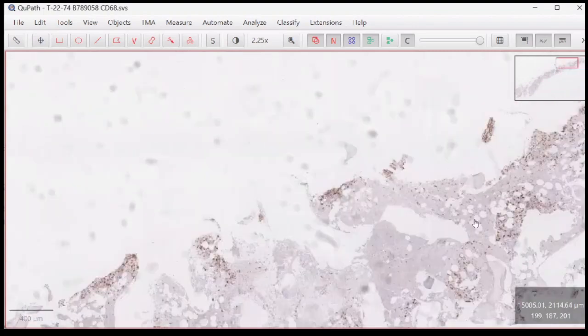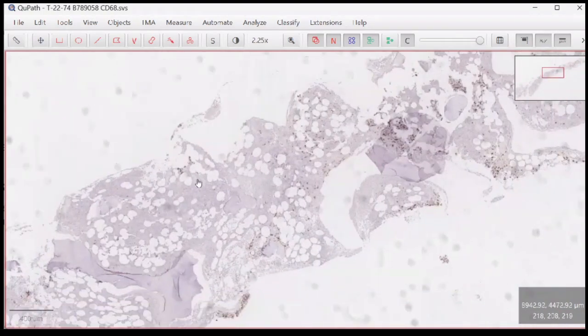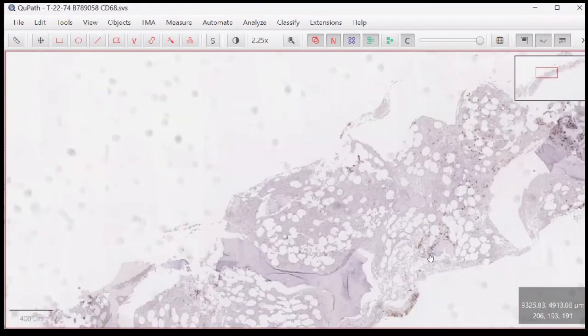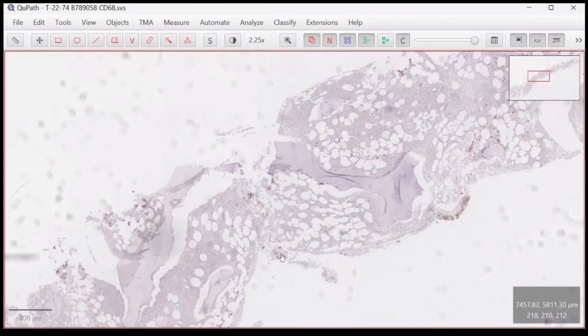The problem with CD68 post chemo is that within 1 month of the last chemo, CD68 will be increased. That's a part of the recovery. You have erythroid, you have granulocytes, coming together with CD68, but they are all mature or differentiating CD68.